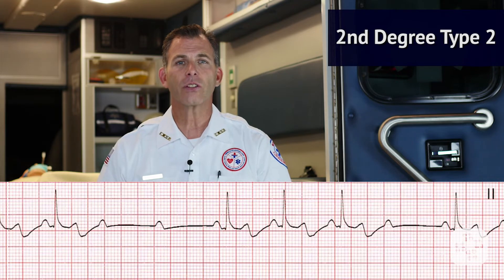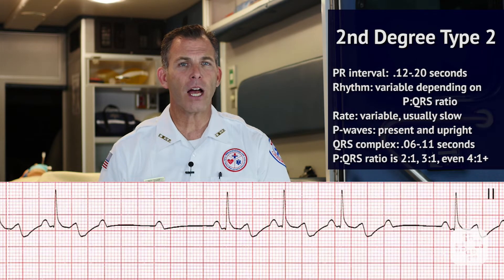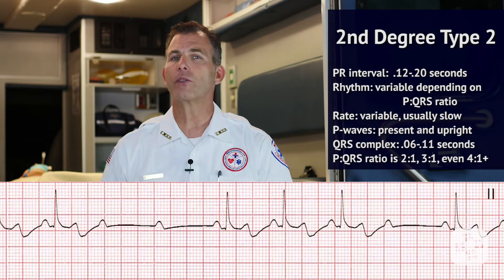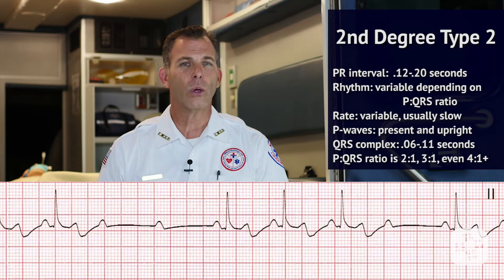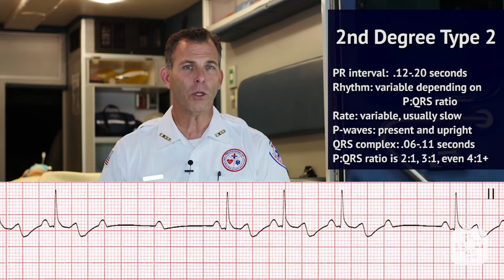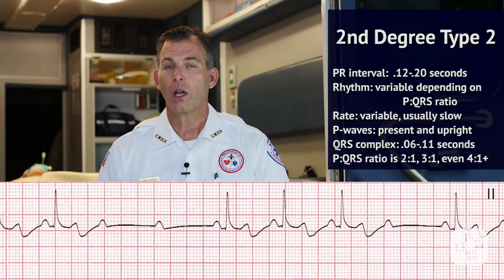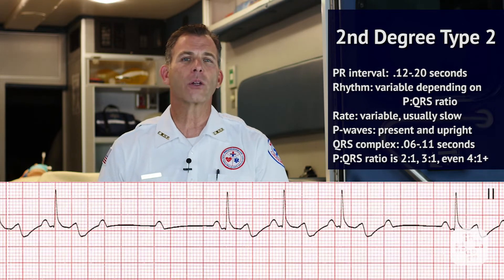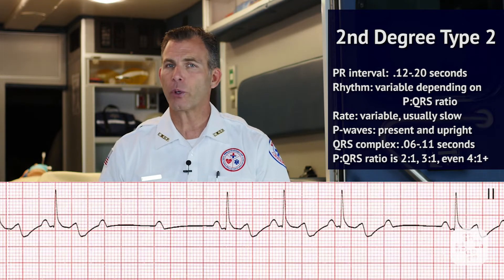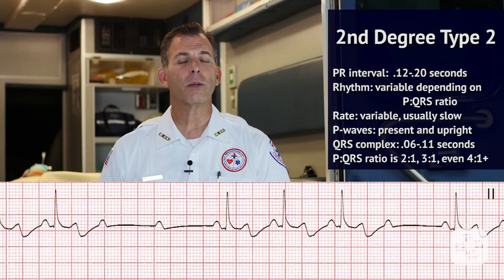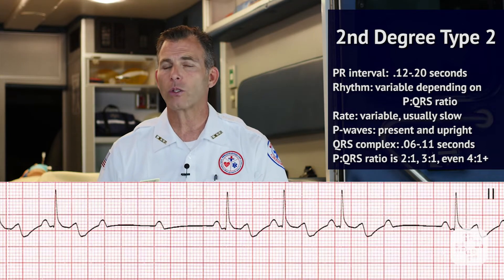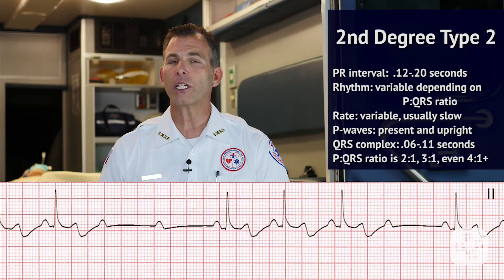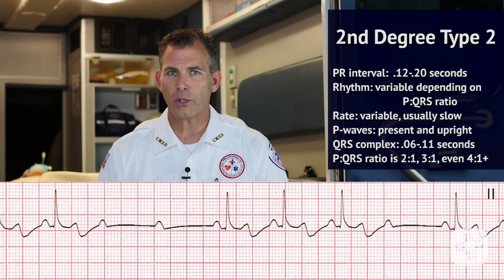In the case of the type 2 heart block, the rhythm is variable depending on the P to QRS ratio. The rate is variable but will usually be slow. While P waves are present and upright, the P to R interval will be between .12 and .20 seconds of the normally conducted complexes.